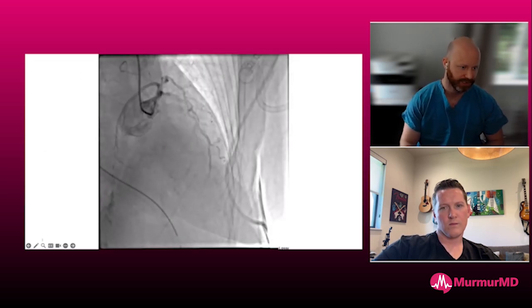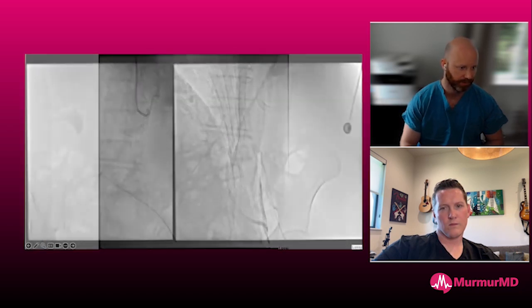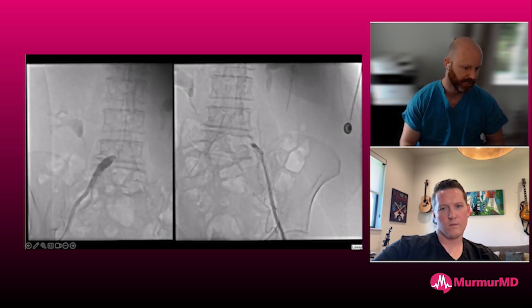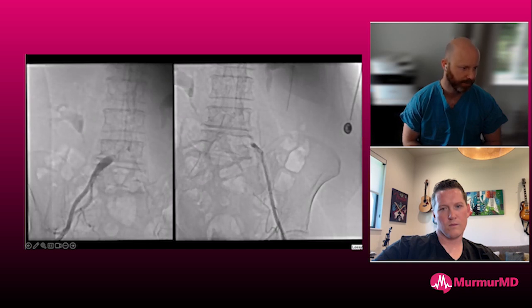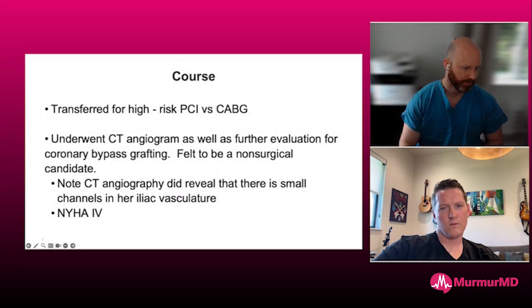She had these angiograms. You can see she has diffuse LAD, severe calcified disease, and left main bifurcation disease. She's in a bad place. She has a non-dominant right coronary. They did take some iliofemoral pictures because they were contemplating placing an intra-aortic balloon pump at the hospital. However, in these two pictures you can see she probably has severely stenosed iliacs. They felt it was occluded, but based on the competitive flow, we felt it was probably just severely stenosed. She was brought to our center so we could discuss whether she would be a high-risk PCI or a CABG patient.